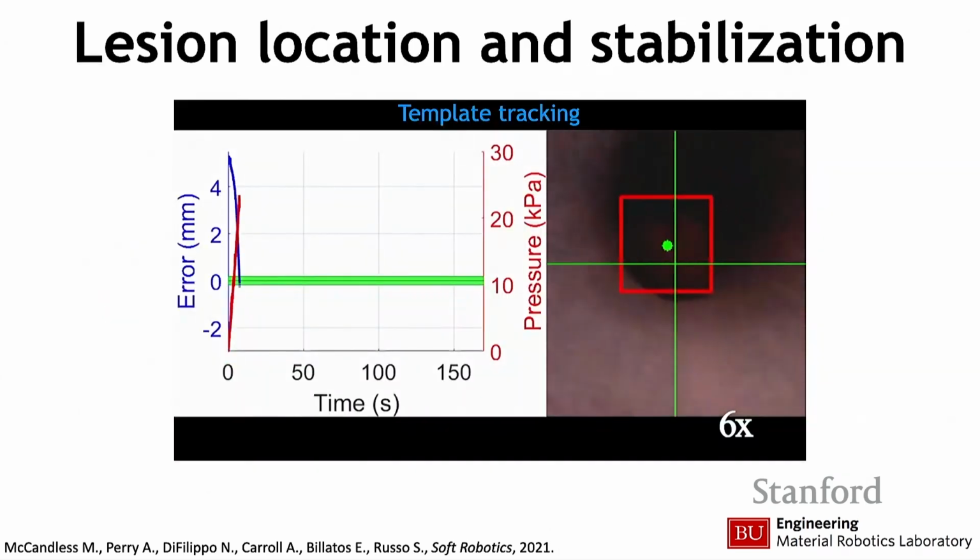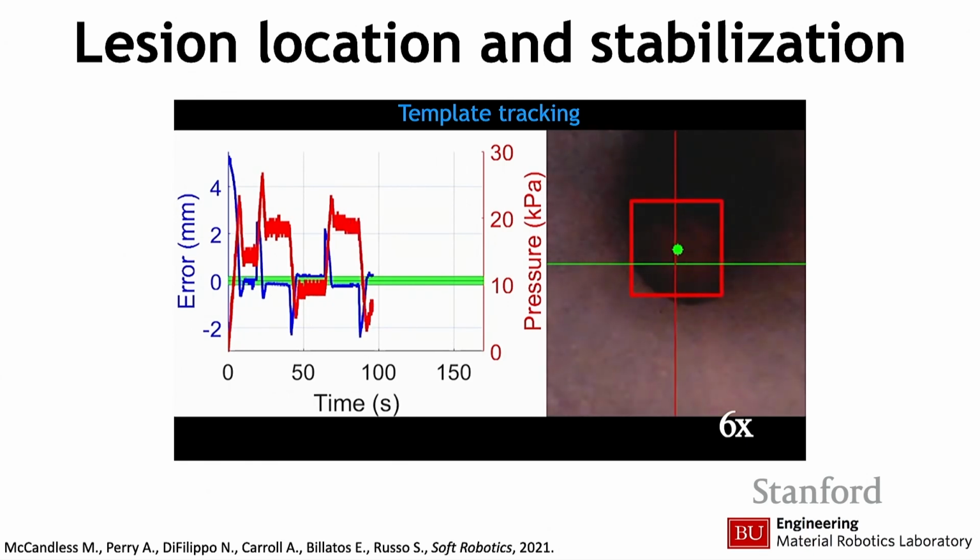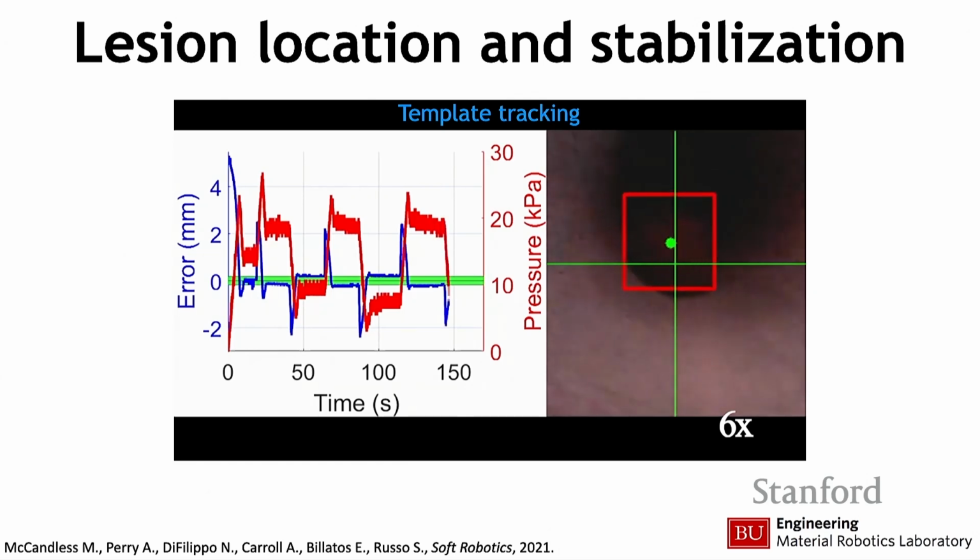And the other thing, of course, is that by using computer vision algorithms, we can help the robot compensate for breathing motion. You have to imagine that the lungs are expanding quite a lot as you're breathing, and the surgeon is performing biopsies. So you have to be sure that you're actually puncturing where the tumor is. Compensating for that type of motion is very important for us.